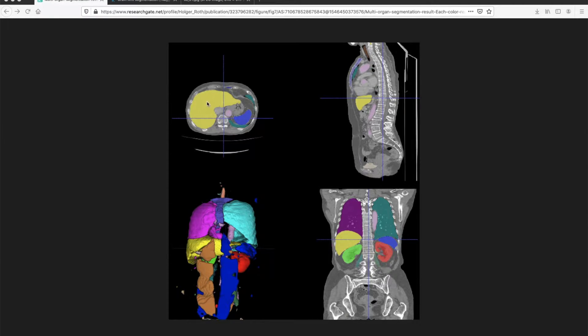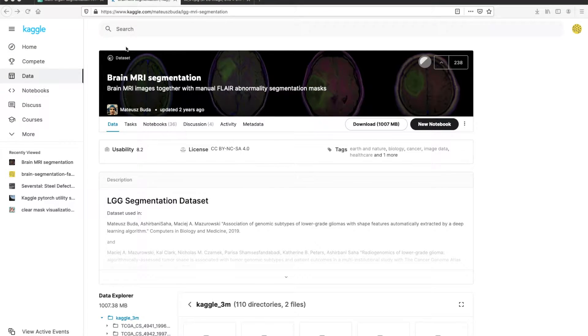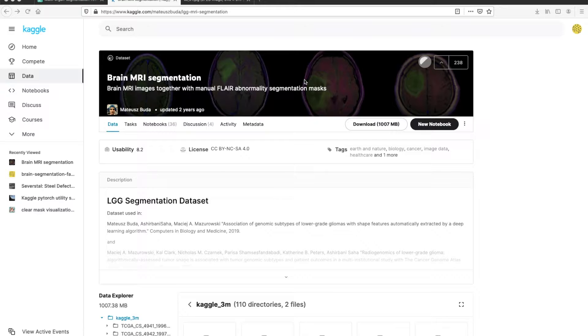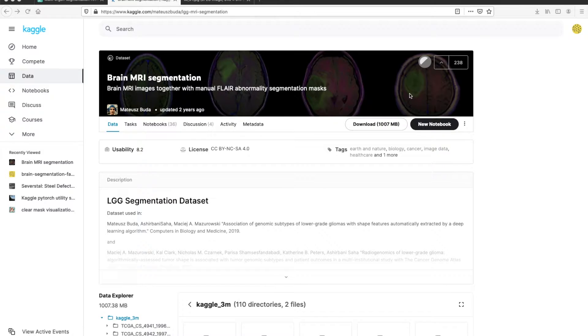I will demo this on the brain MRI segmentation data. This dataset contains MRI images of brains and the task is to detect abnormalities in those images. You can see some of the images here.